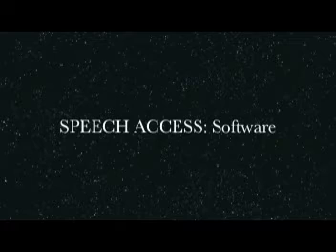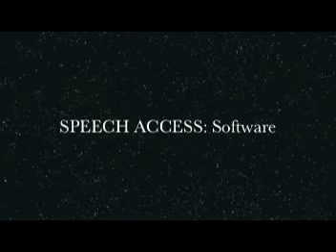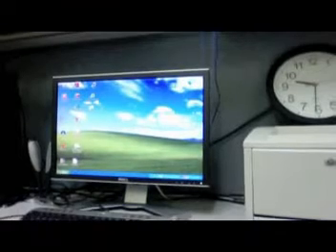Speech access software. What the screen access does is it shows to you what is on the computer screen.